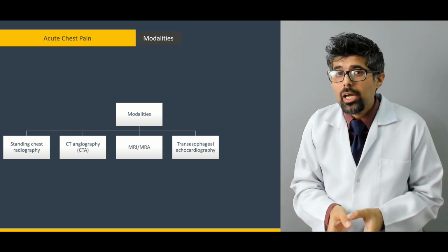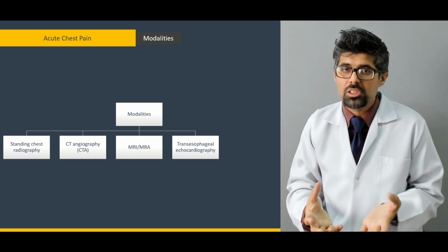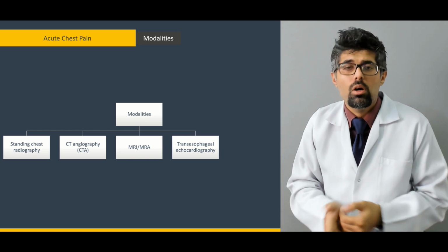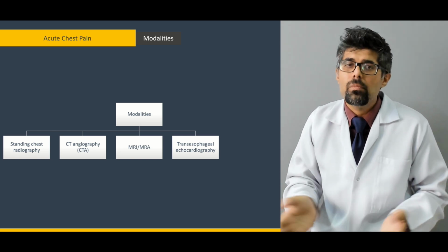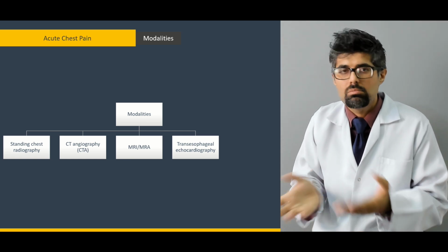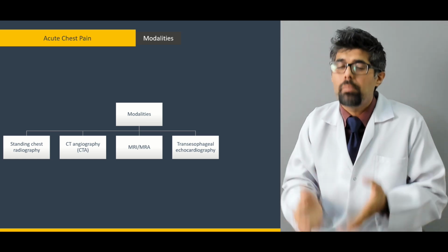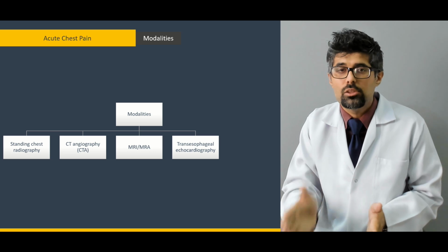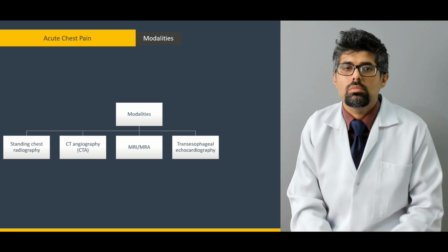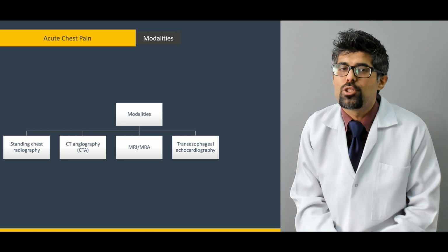It is more accurate than the transthoracic one, but it is also more cumbersome. It requires the patient to have some kind of sedation or anesthesia, and it is only good in few instances, like the valvular diseases. Valvular diseases are better visualized in a transesophageal echo. In a transthoracic one, all the other problems can equally be visualized.